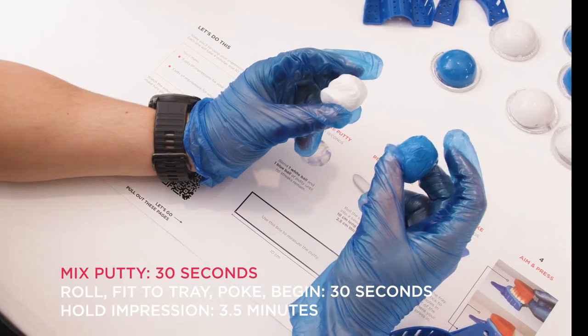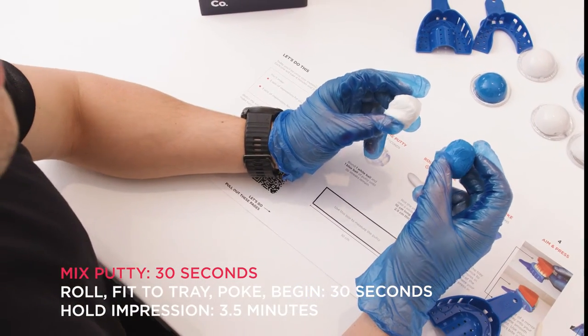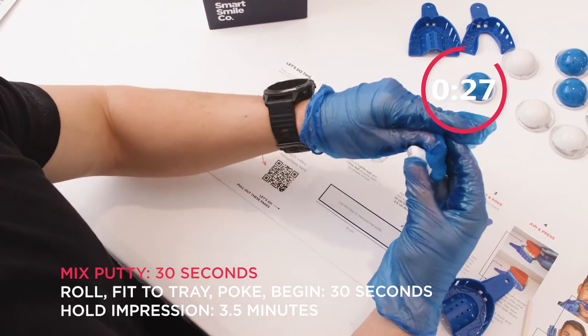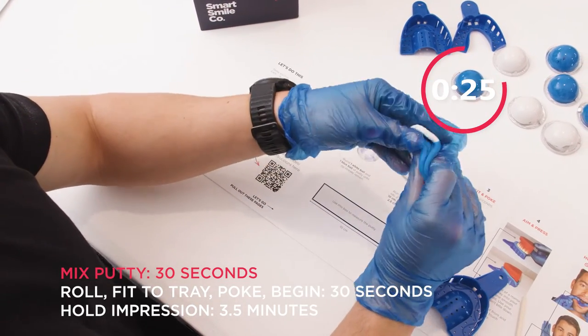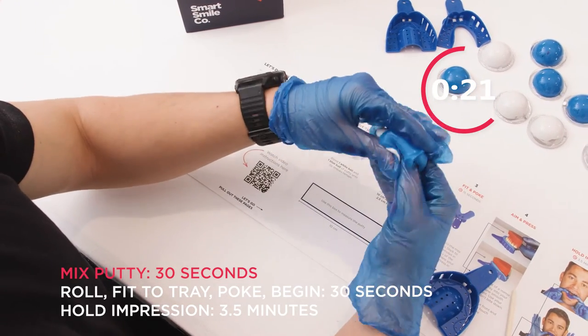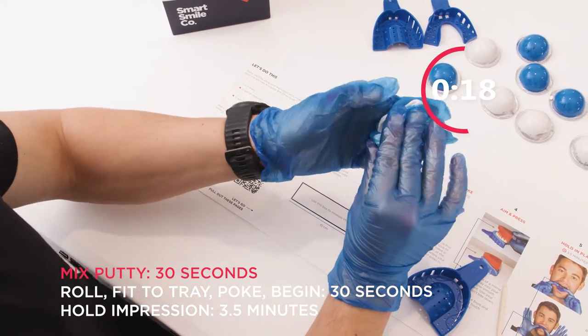Gloves on — open the putty and let's start. Mix the putty for 30 seconds vigorously until there is only one single blue color with no white streaks. At the end of 30 seconds, we are going to roll a 10 centimetre sausage and check its size on the fold-out.